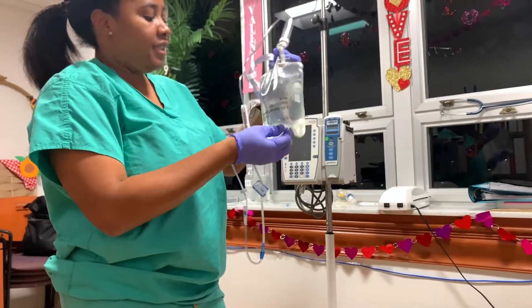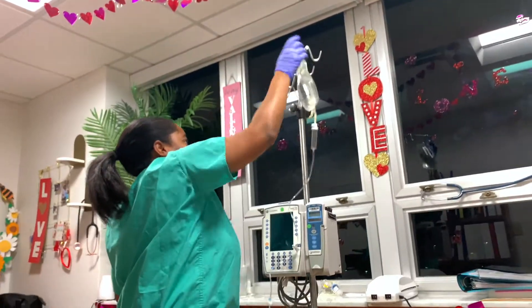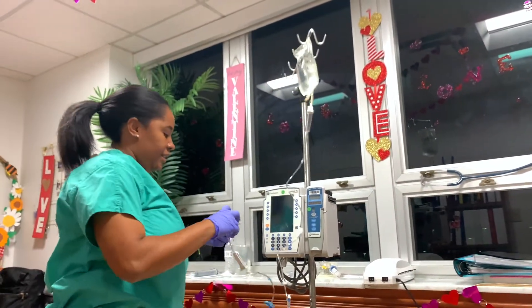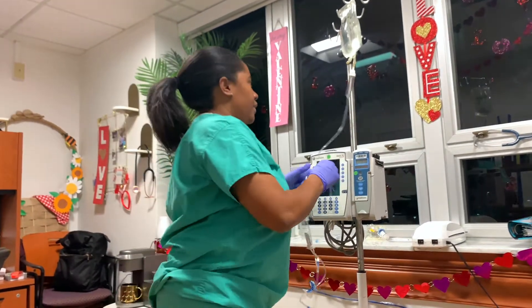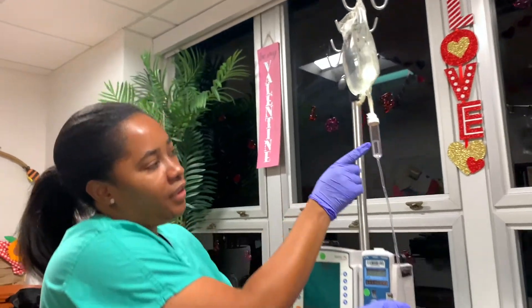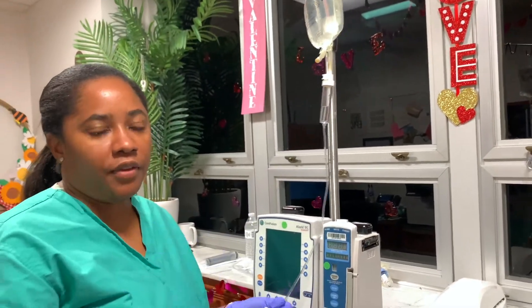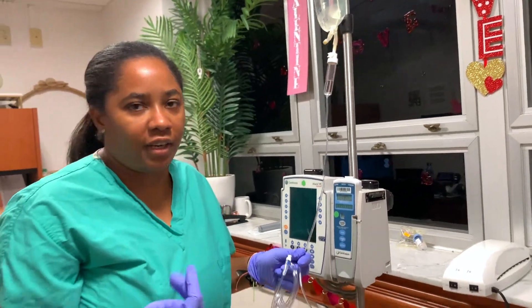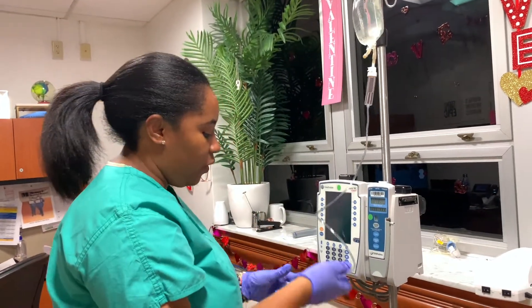Everything is clamped, so now I'm going to go ahead and hang my bag upside down. Now what we are going to do is slightly fill up our drip chamber. You never want to fill the chamber all the way up. The reason for that is because you want to make sure that you are seeing the fluid actually dripping, especially if you are not sure whether the patient is receiving medication. So you want to do it about halfway as opposed to filling up the whole chamber.